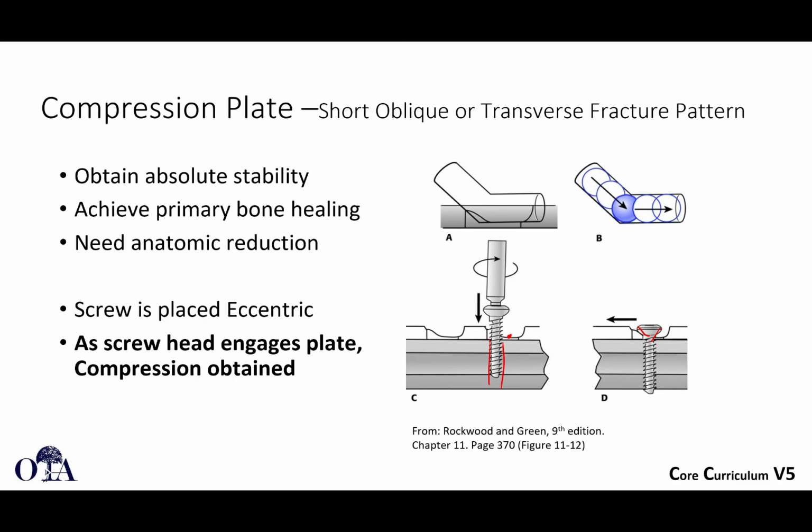And if the plate is otherwise fixed on the other side of the fracture, that will allow this fragment to move this way, and relatively speaking, for compression.